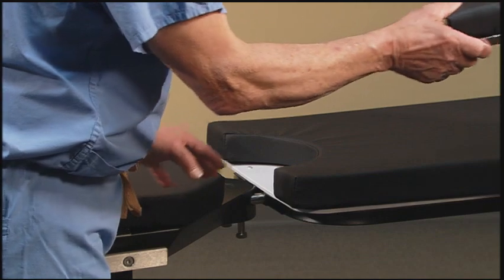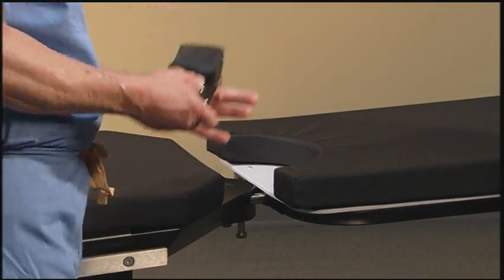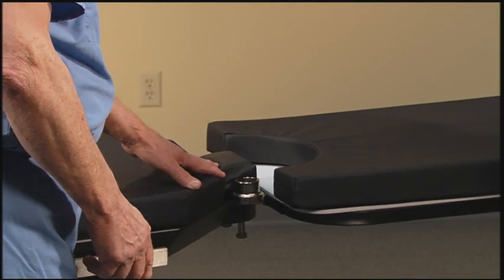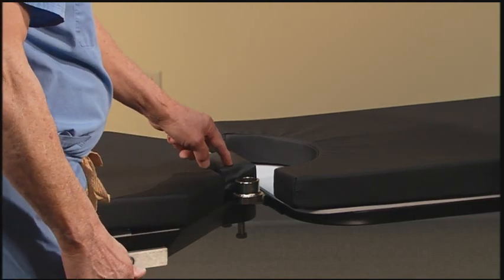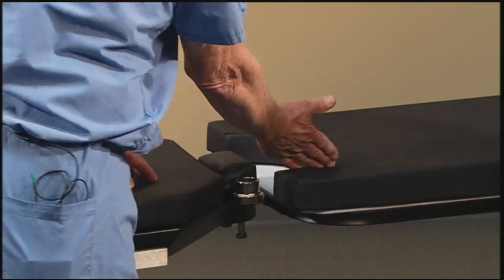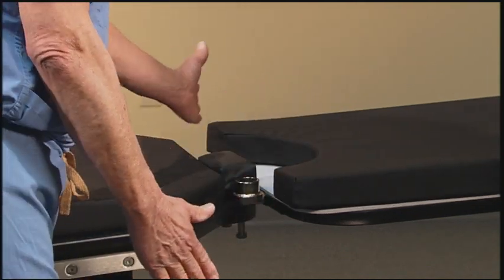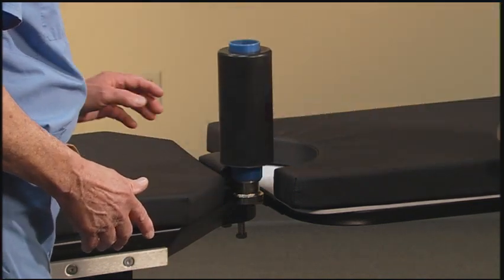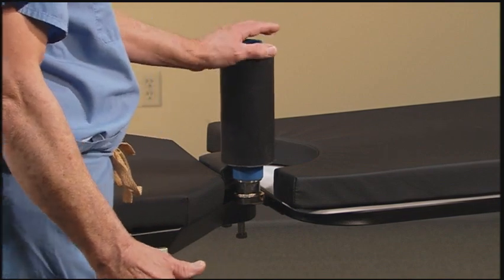There are two pieces to the perineal post. This is an offset bracket — it can be used to move the patient's hip off of the table for better C-arm access. The bracket can be attached at the 3 o'clock, 1 o'clock, 11 o'clock, or 9 o'clock position. Once that is in, the perineal post is dropped in and the patient is pulled down tight against it.